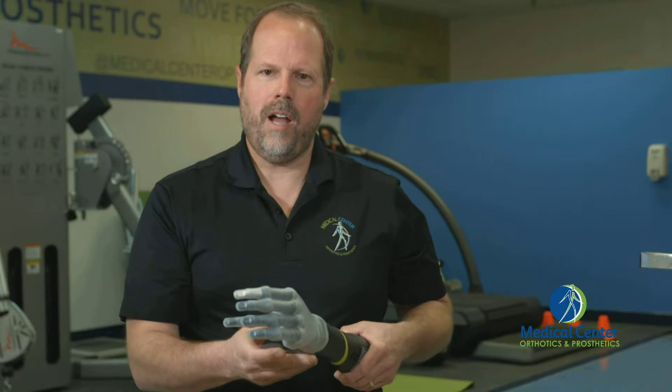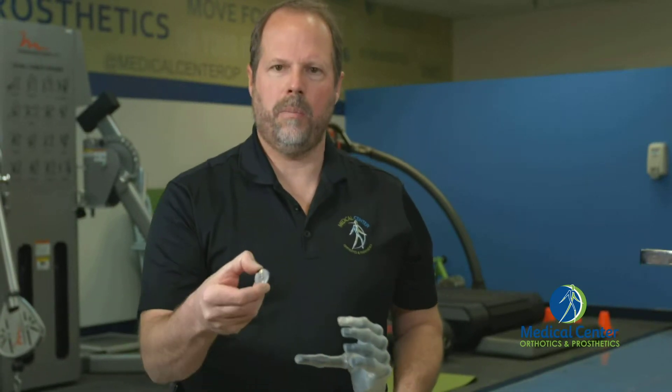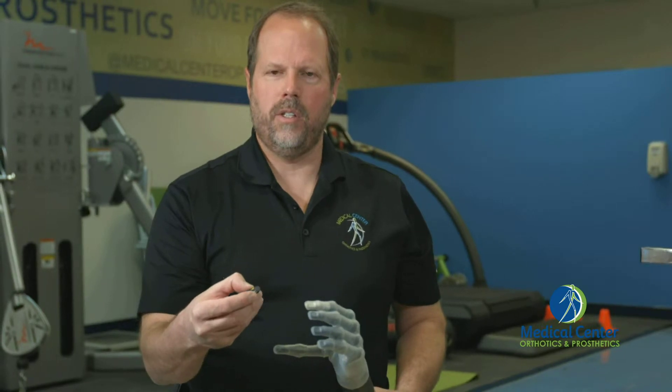We can also use gestures to drive into the hand positions. We can use these grip chips and place them in our environment, so the user can put them around different things in their environment — their computer, their coffee maker, maybe a coat closet.